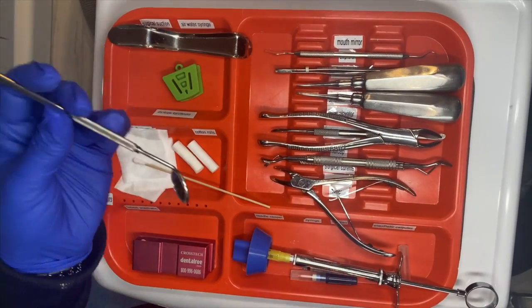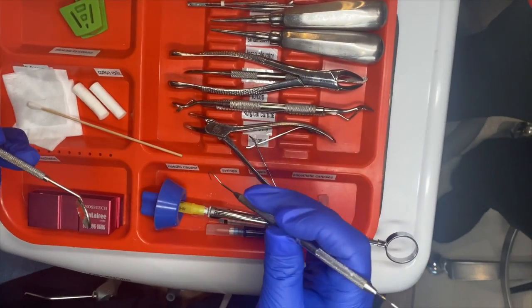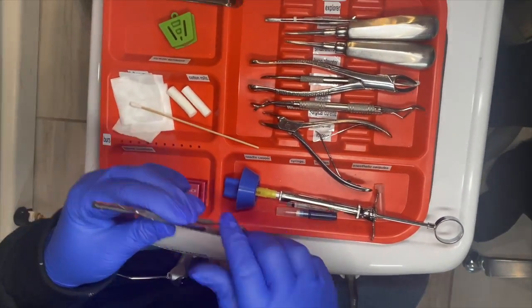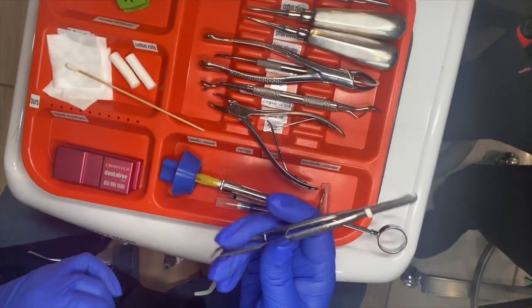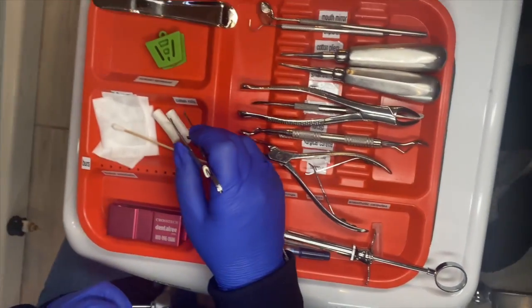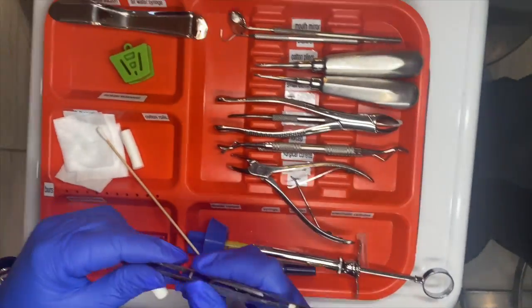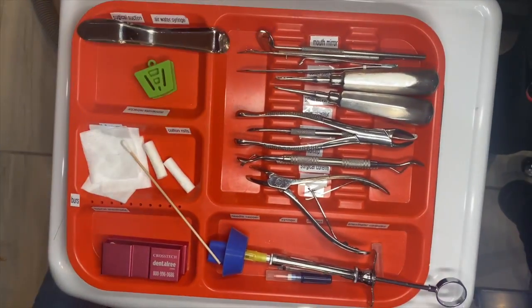We have our mirror, which is good for retraction — holding the tongue back or the cheek back, anything to get it in or out of the way. Explorer, and it's a little shepherd's hook, just to help see and remove tissue as needed. We also have locking cotton pliers — locking, so when you pick something up they lock and you don't have to worry about dropping anything.